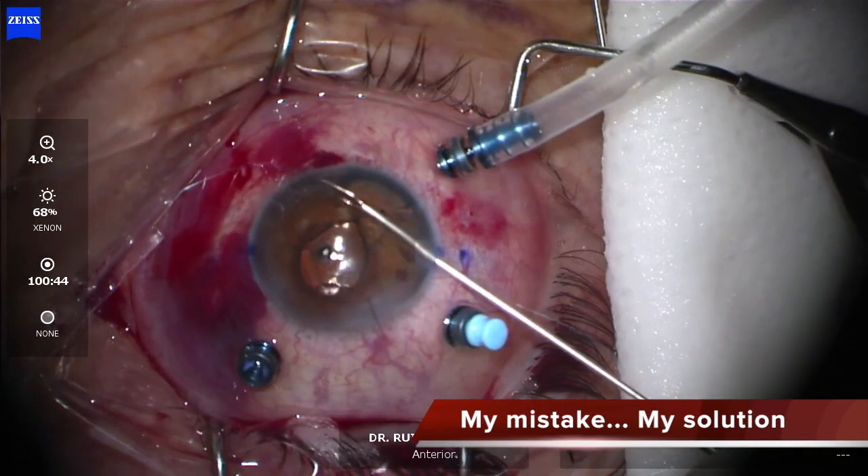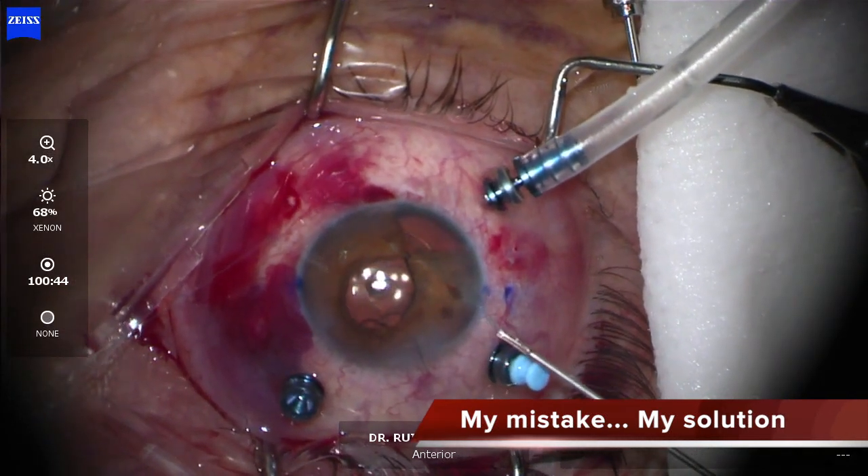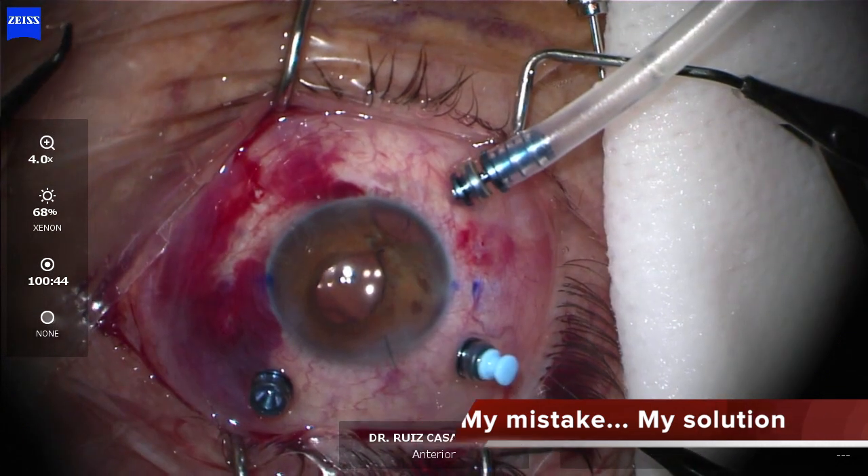And fortunately I could fix this case in which I had made a mistake in the first surgery.